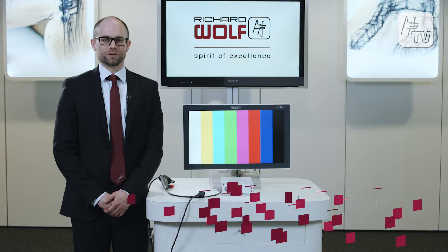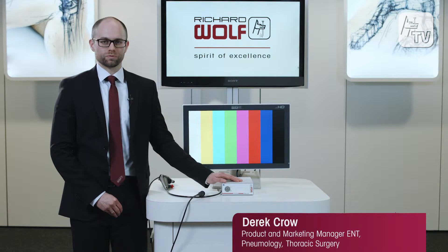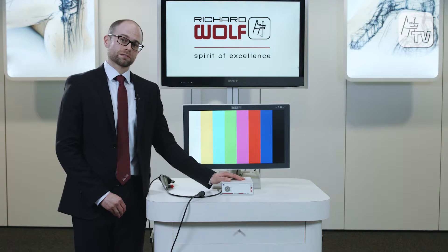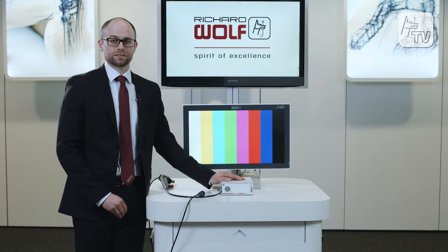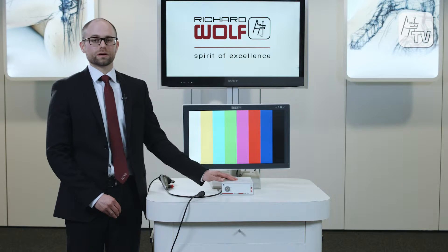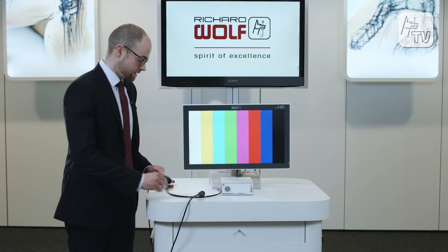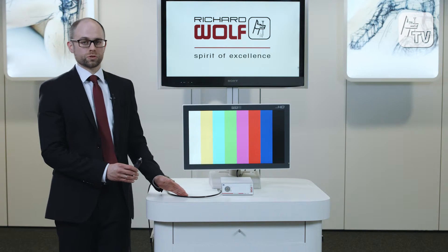Today I would like to introduce to you the new innovative Endochem Flex HD video system from Richard Wolff. It features a compact controller design together with a VESA 100 interface to mount on any existing equipment carts. The device is very simple and is compatible with the three new flexible bronchoscopes from Richard Wolff.